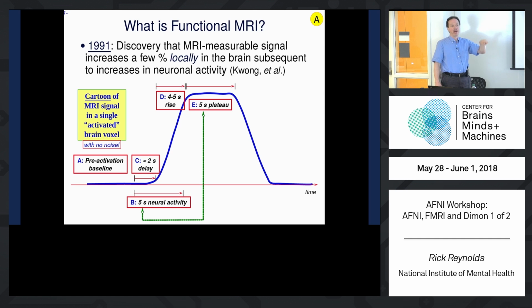But then we convolve that with a boxcar function that is 5 seconds of stimulation, convolve that with the incomplete gamma variate curve, and you get a bigger incomplete gamma variate curve. That will not plateau until your stimulation exceeds the duration of the basis function, the simple curve. So if your simple curve is 12 seconds, you don't get any plateau until you have 12 seconds of stimulation, or more than that. So this isn't really how we analyze data.